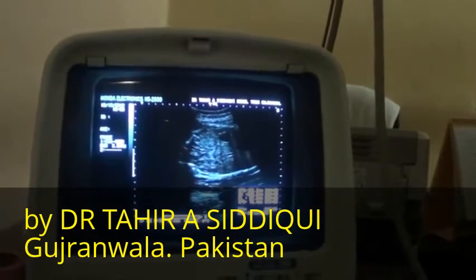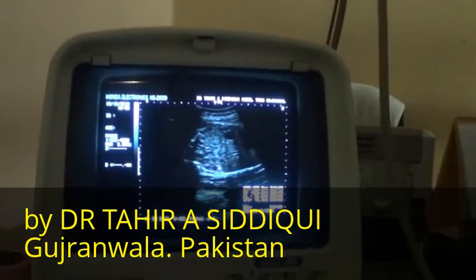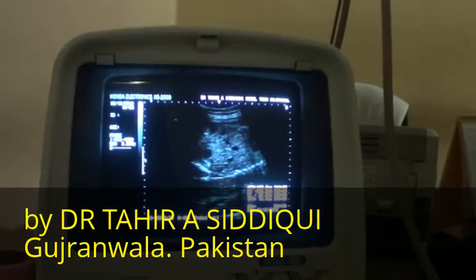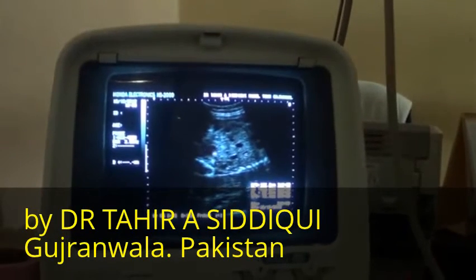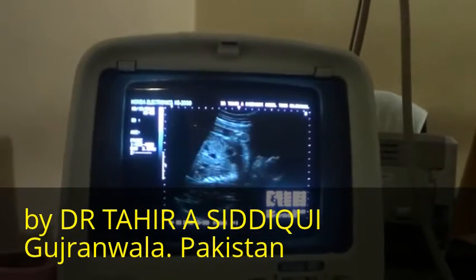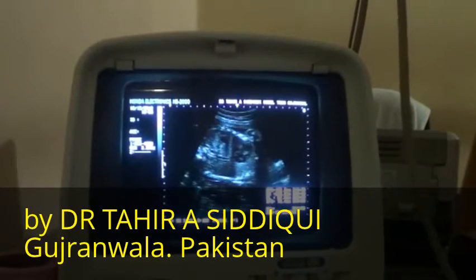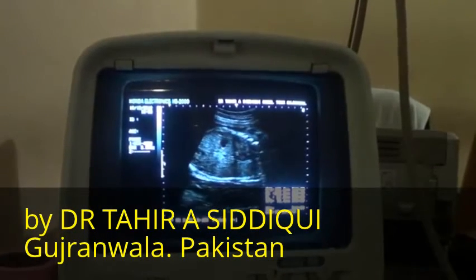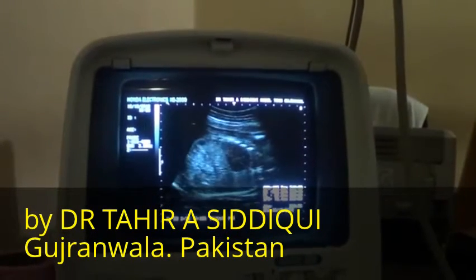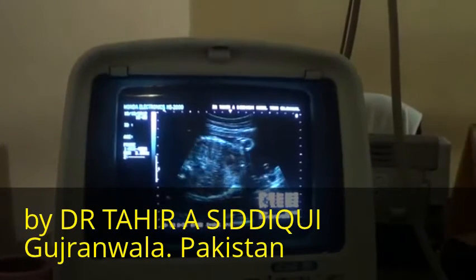Here we can see the second kidney. This is the second kidney, fetal kidney. And this is the urinary bladder. Now let's come to the chest. The chest is normal.